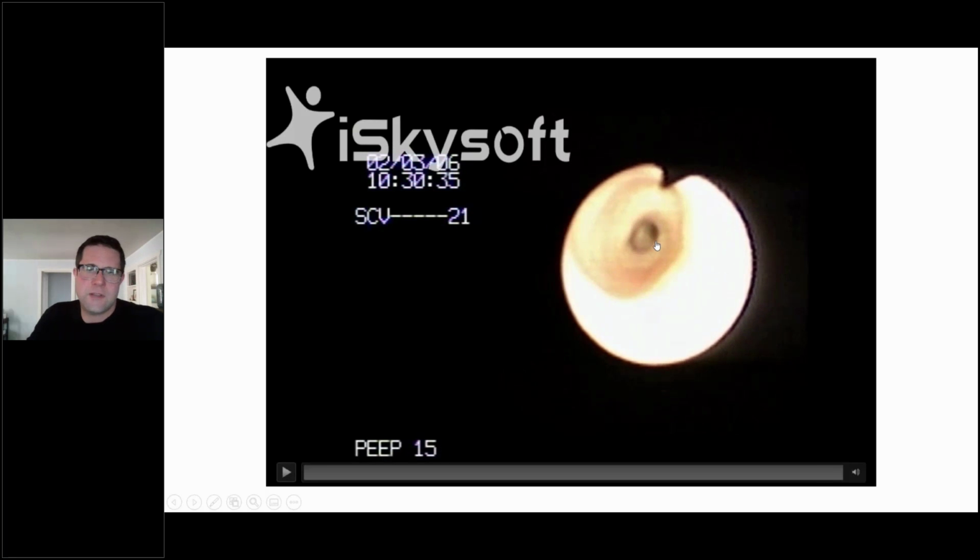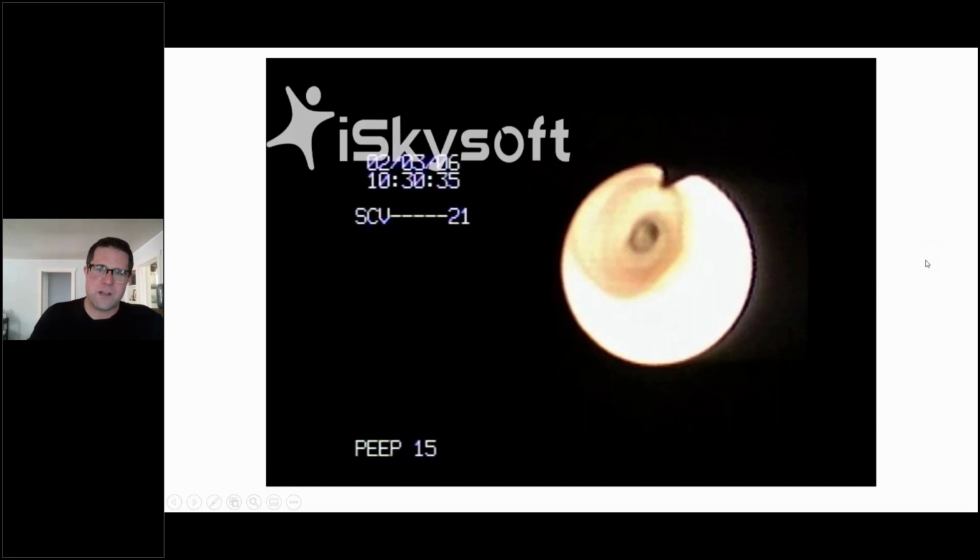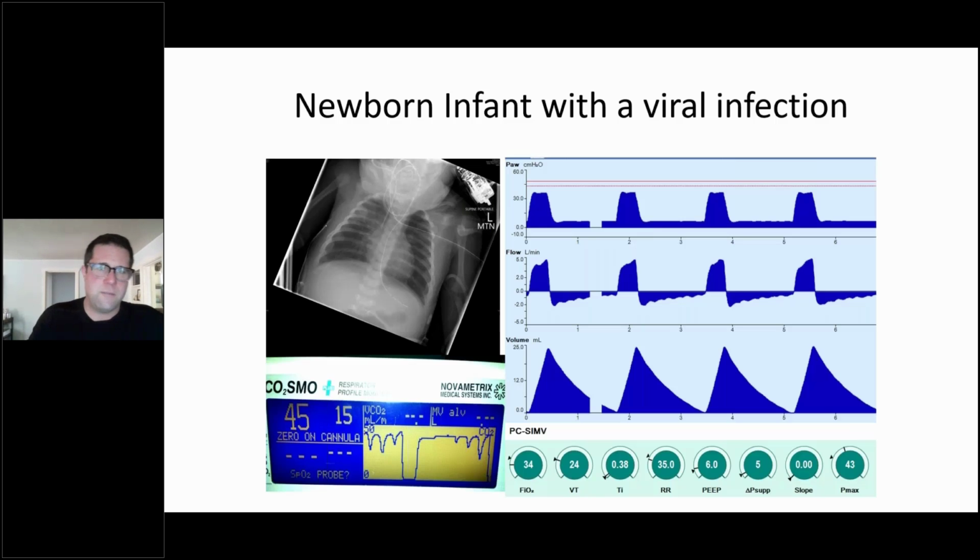And so I think, with a bronchoscope, you create a choke point, and it's not as realistic as a patient who doesn't have a bronchoscope in there. So I'm not sure that you really need a bronchoscopy study to be able to identify tracheomalacia. In fact, we could rely on airway graphics instead of putting a scope down there and getting something that's kind of misrepresentative of what's truly going on day to day.